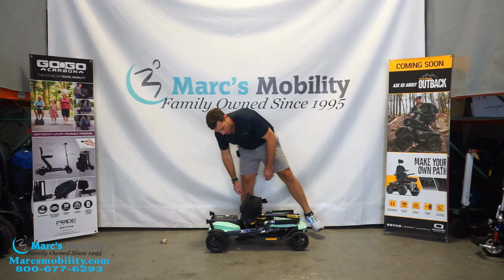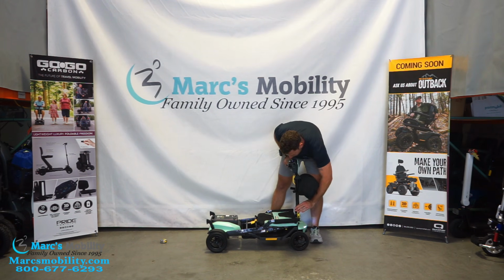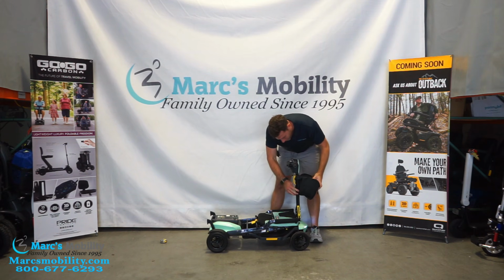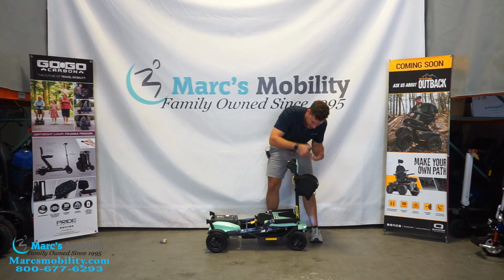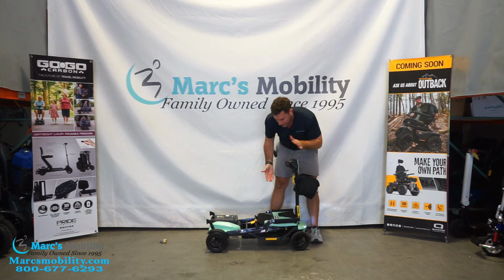So now from here, I'm going to go ahead and just do the reverse. I'm going to raise the front tiller back up. Now there are Velcro straps on here that are holding this front basket from the bottom. Since I had it off earlier, that's why it was not strapped on. But basically you can lift this front compartment up and take your front bag off to get this even more condensed at a certain size.